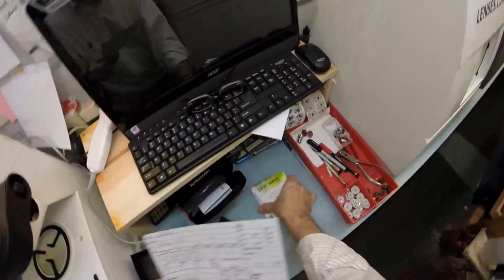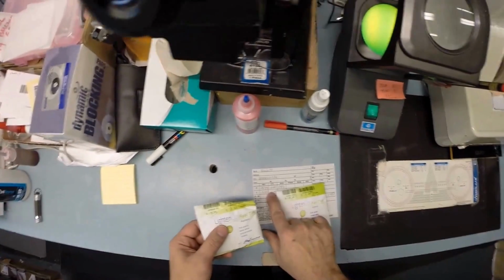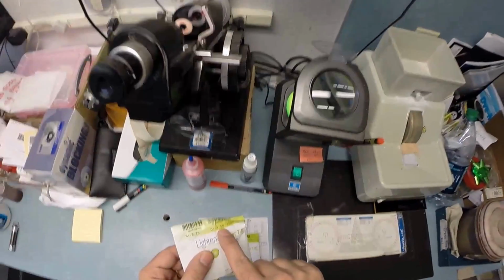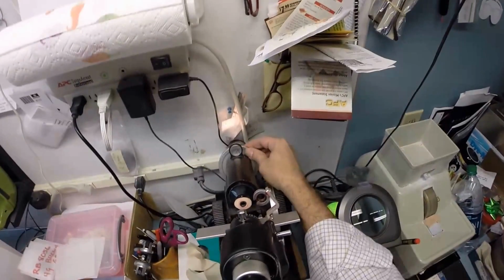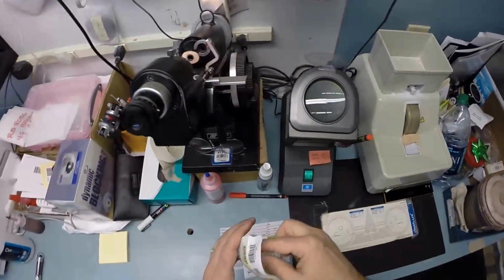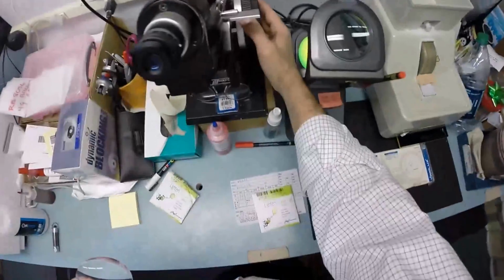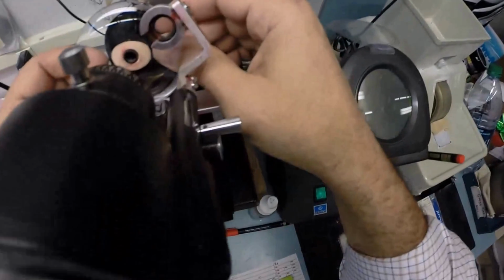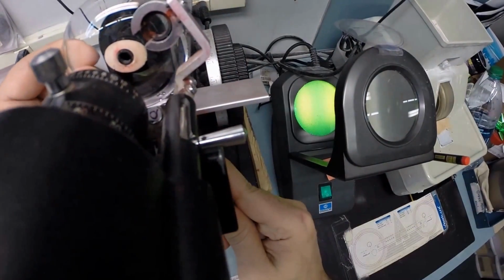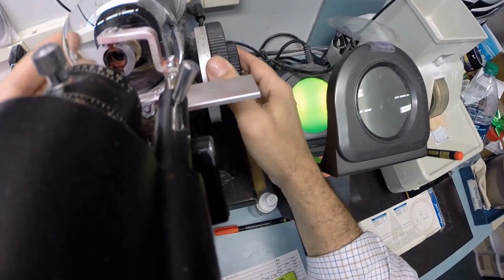And let's go ahead and get your lenses prepped. Your right lens reads -3.75, -1.50 at 82. I'm going to put the axis wheel on 82. Hopefully you can see that in there. Take your lens out of the protective sleeve. Let me make sure the lensometer is lined up correctly. It is. I'm going to turn the power to -3.75, and I'll show you that in better detail later. Rotate your lens until the sphere power comes in clearly. Locate the optical center. Check that against your astigmatism correction, which I'll explain later too.